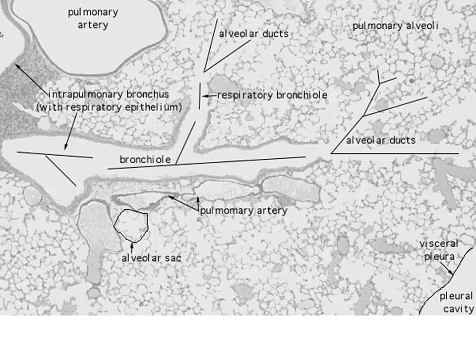Now, I don't like them using this term, bronchus, because we don't see any cartilage present around this bronchus. So in this particular field, it might be on this side, but I'm not seeing any cartilage at all. So I don't know why they would put that there.